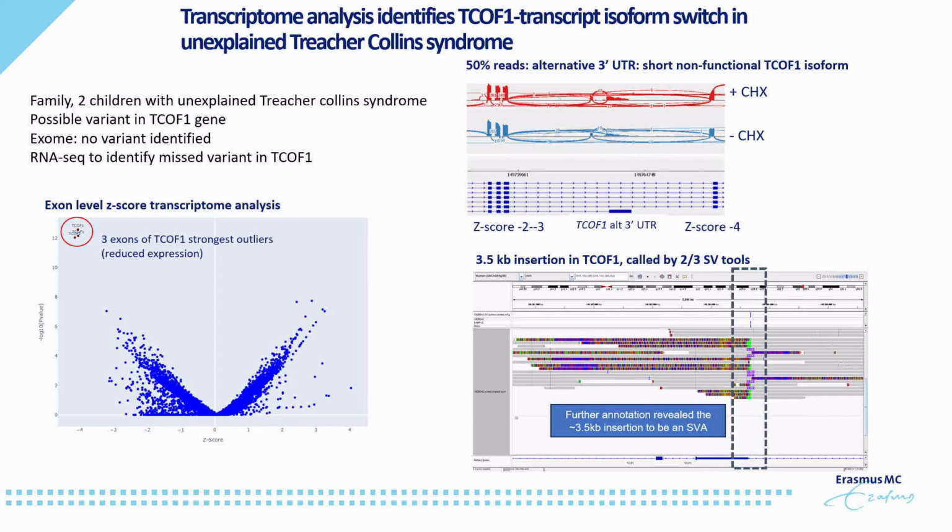And we confirmed this by diagnostic DNA analysis. And I guess it shows you, for this case, we actually used all the techniques that we had on hand. We even used BioNano, we couldn't figure it out. We used short read whole genome sequencing, and we also couldn't figure it out. So this, I think, also shows you the strength of combinations like using RNA and long read DNA.